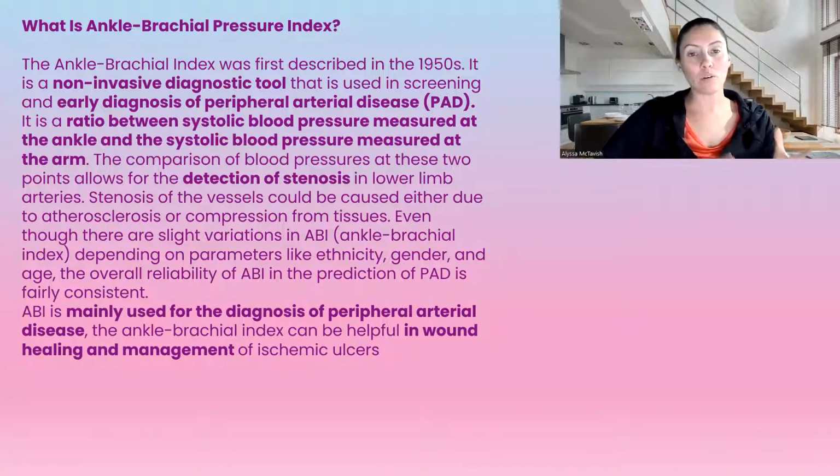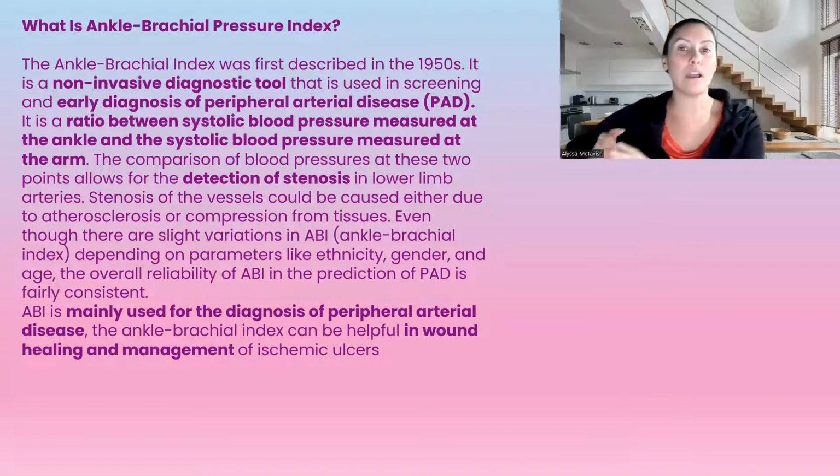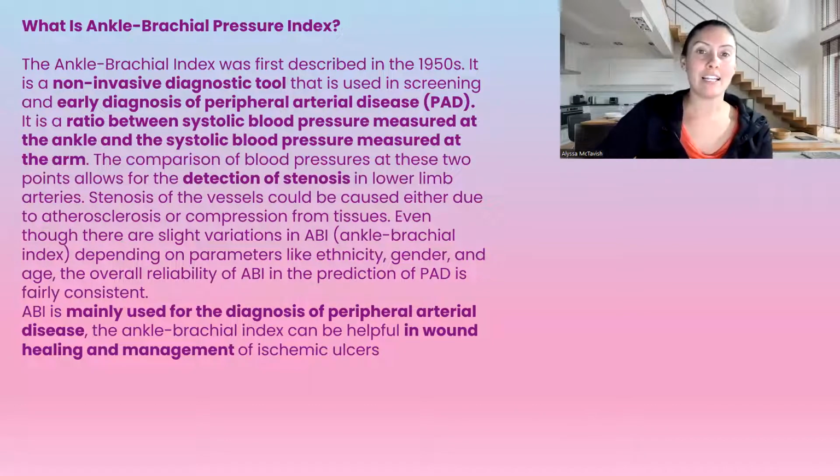ABPIs are mainly used for diagnosing peripheral arterial disease, but they are also a great tool that we use in wound care, for healing and management.